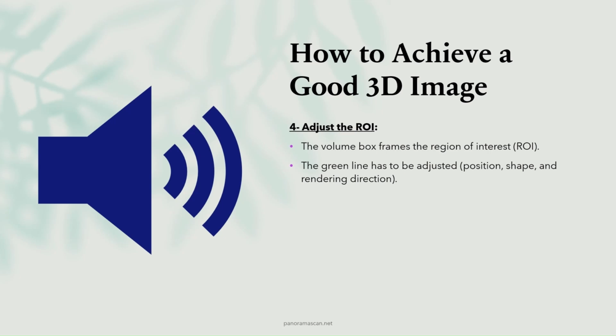On the 2D screen, you will typically see two dimensions of the volume box, which helps in adjusting its size and positioning relative to the anatomy. The third dimension, depth or volume sweep, can be visualized as a small icon on the screen.